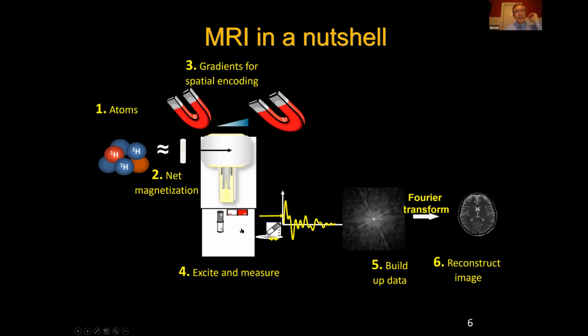And then when you apply the magnet, the spin changes and the frequency changes. So we go, and then when the magnet shuts back off, the protons go back into their orbit and they resume that sound. So we go. And that's really what you're seeing in that little squiggly line down here. If we collect those frequencies, and that's what we call the K-space, and then we can use a fast Fourier transformation to convert those frequencies into a picture.